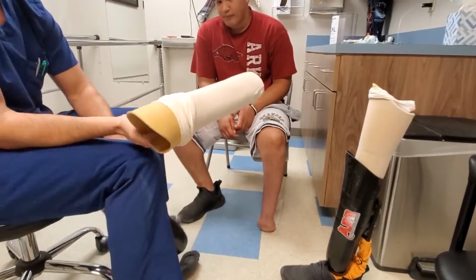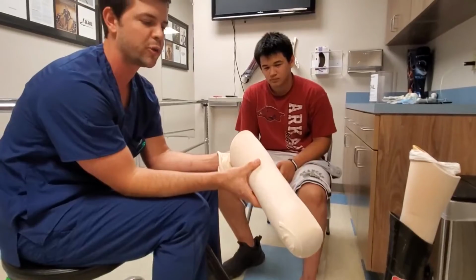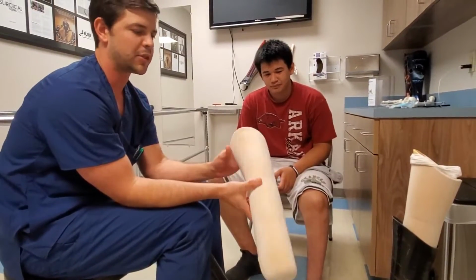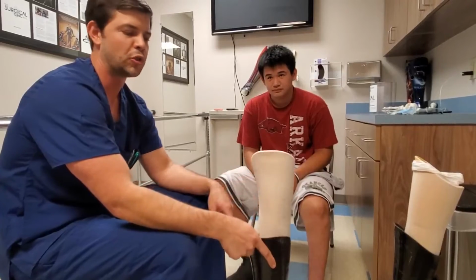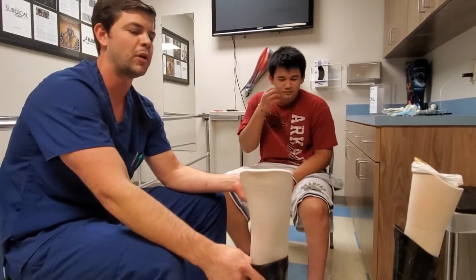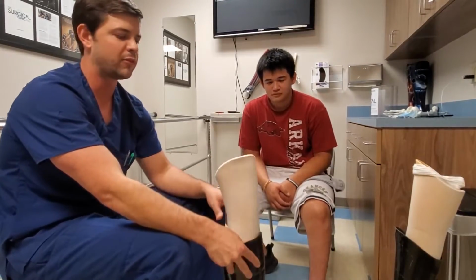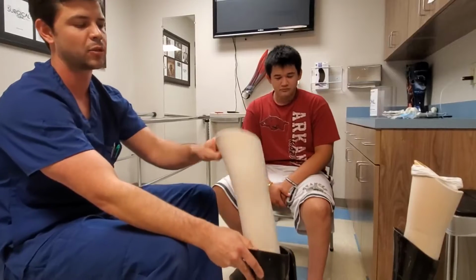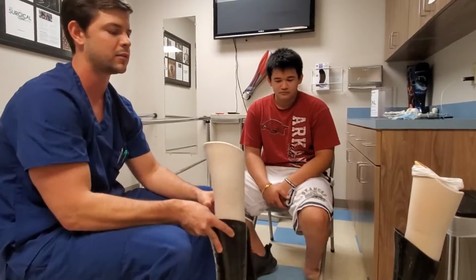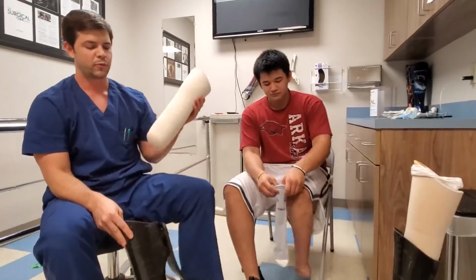I think he wears a thicker sock on this because when you start to run, you might notice some more significant volume changes. So we kind of tell people to sock up ahead of time before a run because things become more loose. You can either sock up ahead of time before a run, or you stop halfway into your run and add a sock. Again, personal preference. If you can tolerate it being a little tight for the first 5-10 minutes, a lot of times it'll kind of stabilize and you don't need to add a sock or take a sock off. So you can go ahead and put that Swiftwick sock back on.